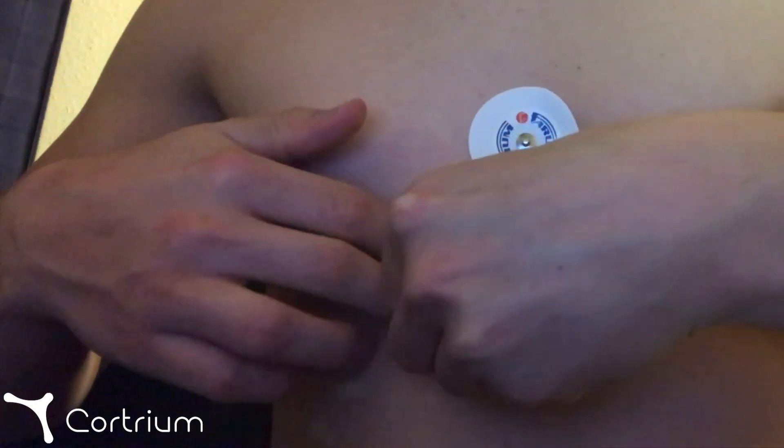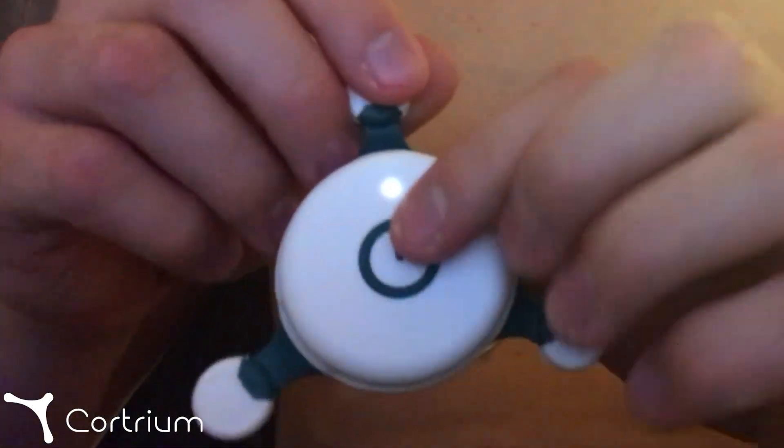After completing the recording, carefully remove the device and press and hold the button for three seconds.